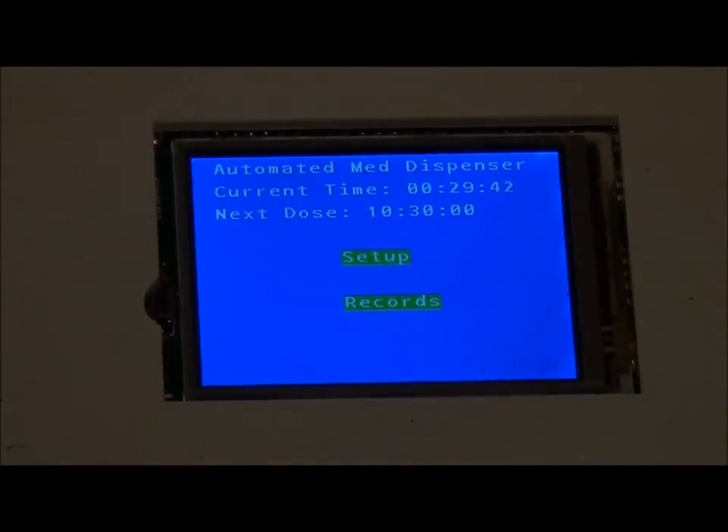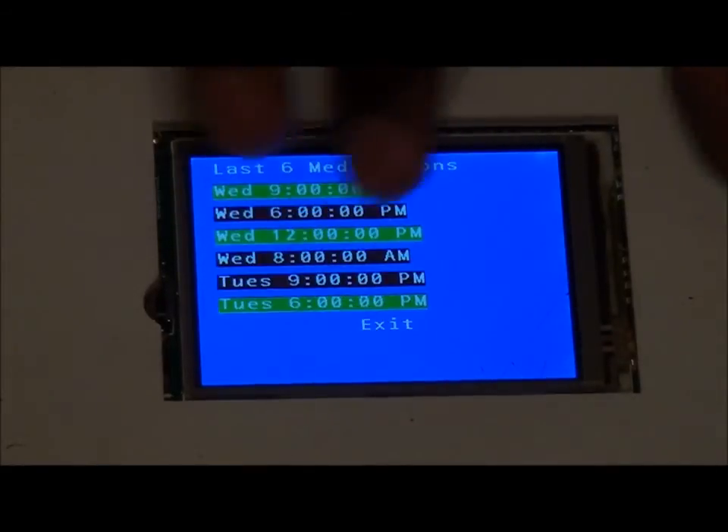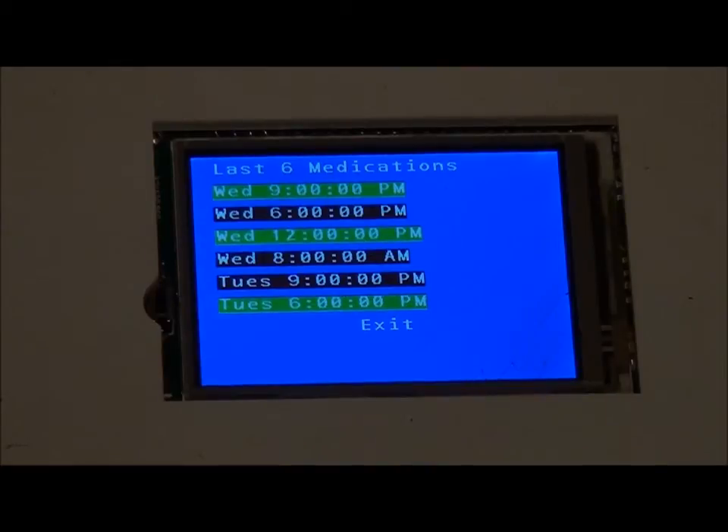At the home screen we can also check compliance for the last six dates simply by checking the records button. Green represents taken medication and red represents missed medication. Further compliance data is stored on the SD card, which can be accessed externally through a USB port.